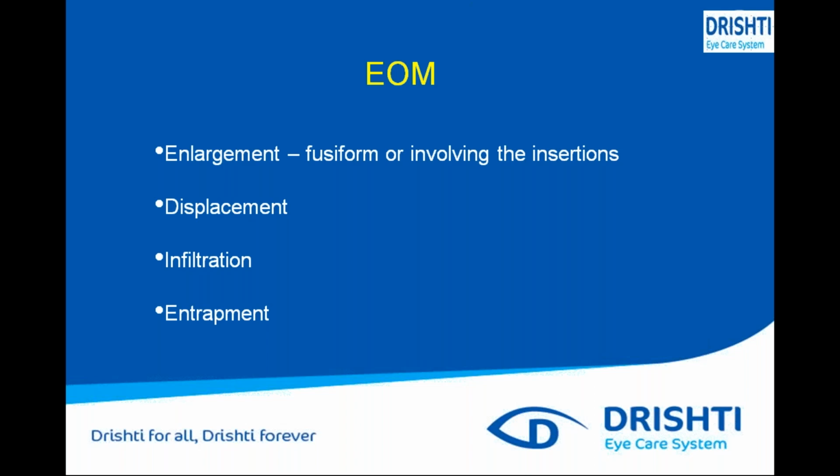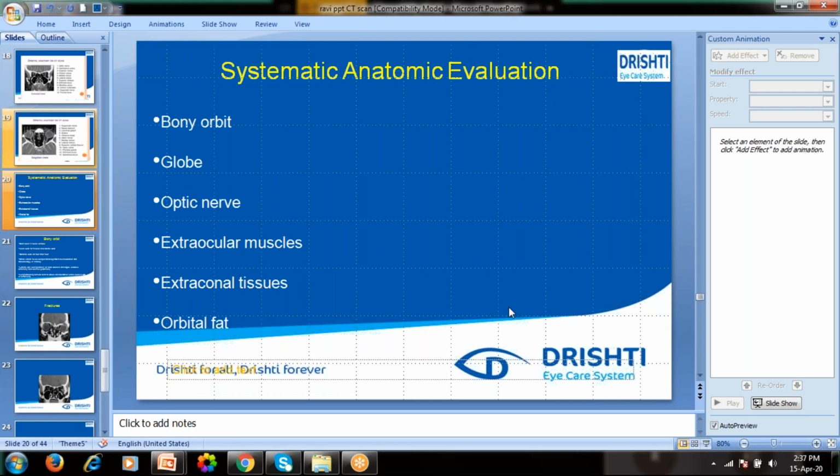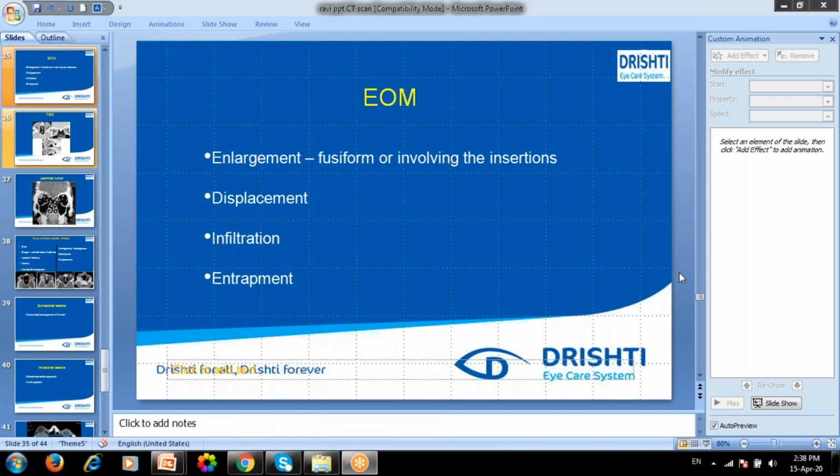So Gautam is asking what should be considered clinically in various CT scans, coronal, axial or sagittal. Sorry, the voice is not clear. What should be considered while doing the CT, sir? Yes, what should be considered, right?